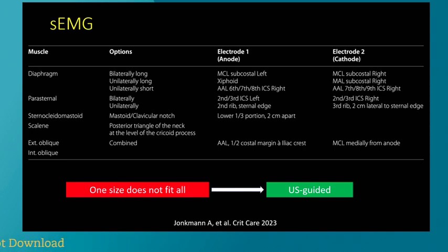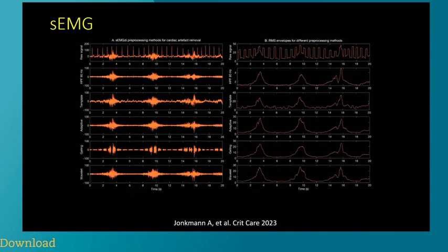One of the limitations that we will discuss is that it's not so easy to place the electrode. The electrode is the same that you use for the electrocardiogram, but according to your anthropometric measures, the place where you have to put the electrode might not be the same. And maybe ultrasound could help us to select the best position for each muscle. However, it's not an easy thing.